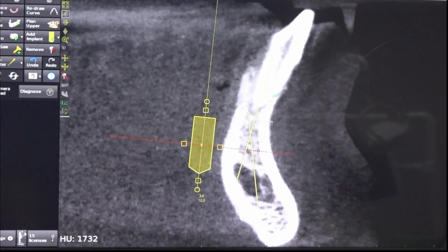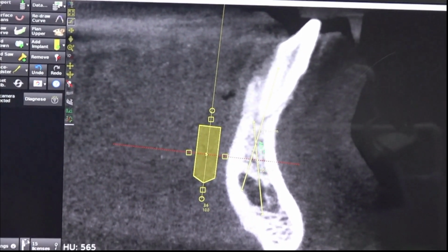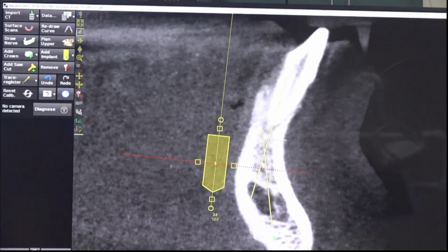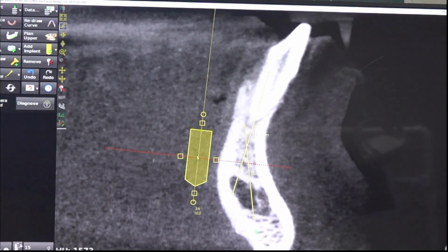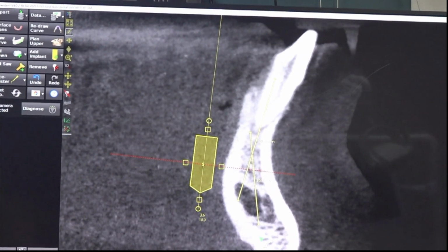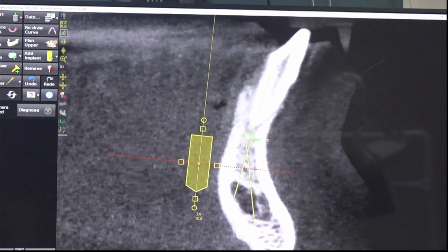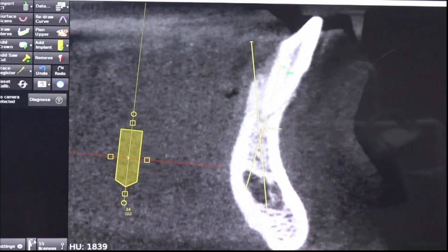If you drill in this angulation, definitely you will reach the lingual cortical plate. But after alveoloplasty, if you do drilling, it will go straight. So the risk of lingual perforation is more when you do only lower anterior cases. If you do full mouth with good alveoloplasty, there is no risk of lingual perforation because the drilling angulation is better now.